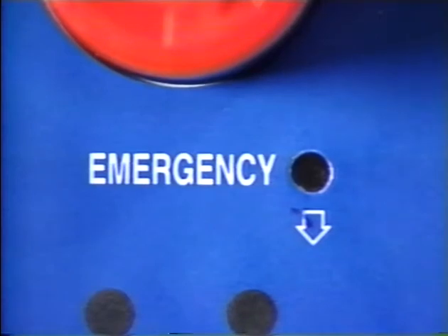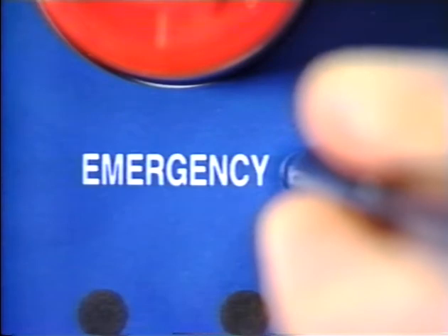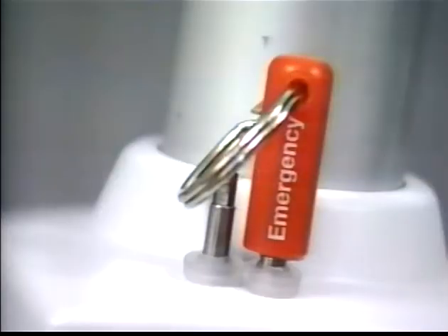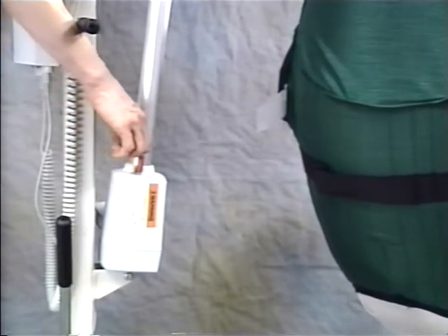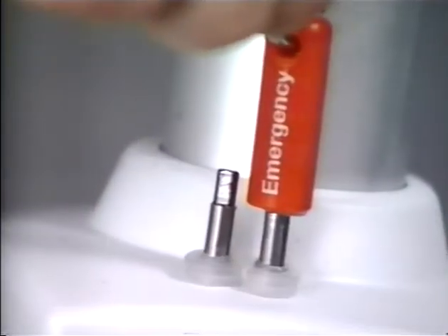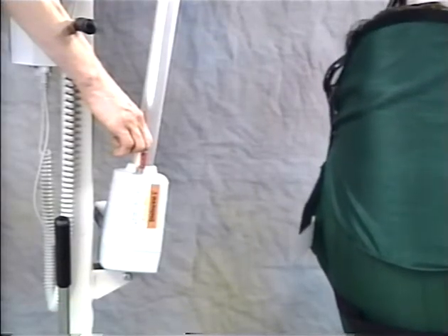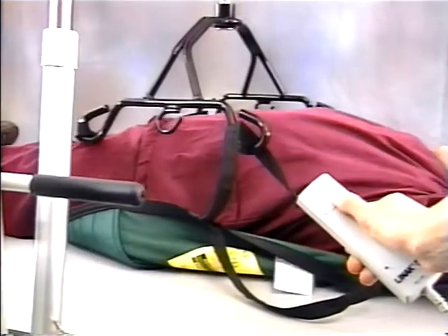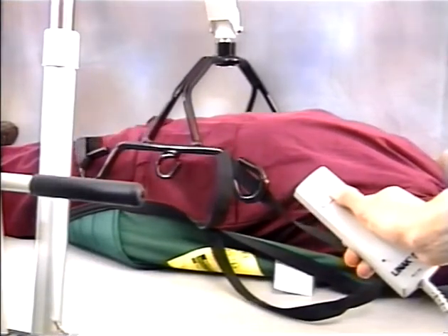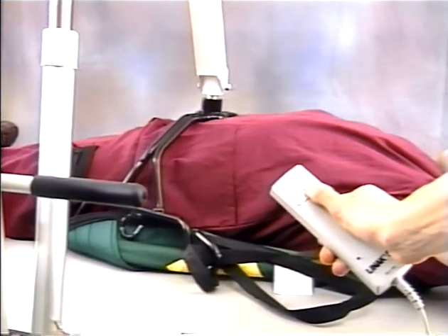In the event the handheld controller malfunctions or is disconnected from the lifter, you can use the override switch to safely lower your patient. Another important safety feature on Hoyer power lifters is the mechanical emergency release pin. If the lifter should ever fail due to loss of power, you can still lower it by pulling the orange pin. It's preset at the factory to lower the resident slowly and safely to chair or bed. Lastly, to prevent patient entrapment or accidental pinching, the boom and cradle will stop automatically if it encounters any resistance while it is lowering.